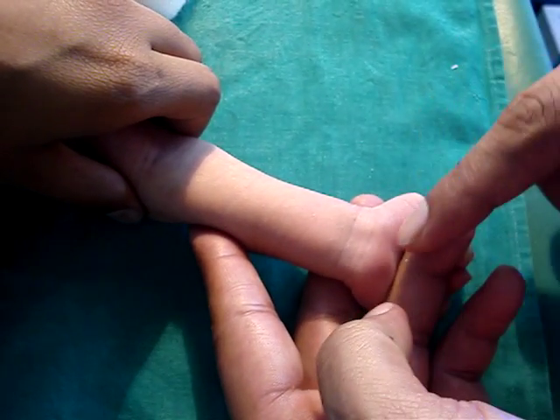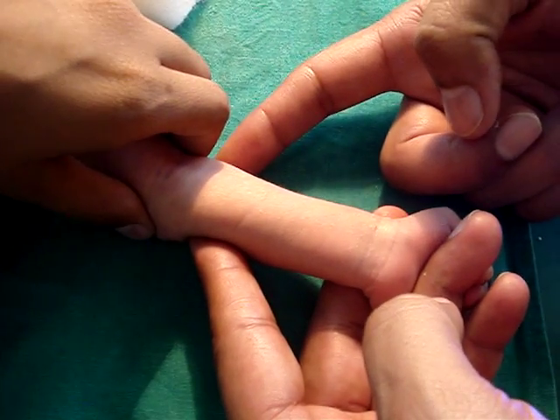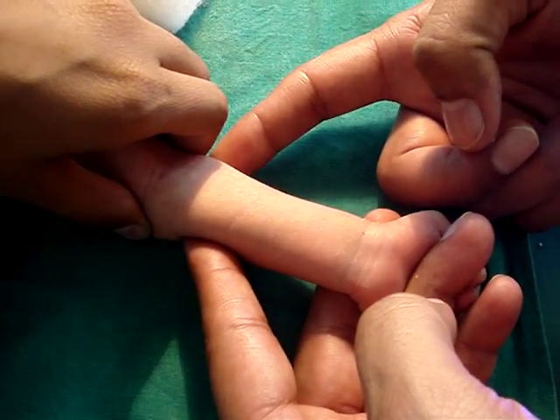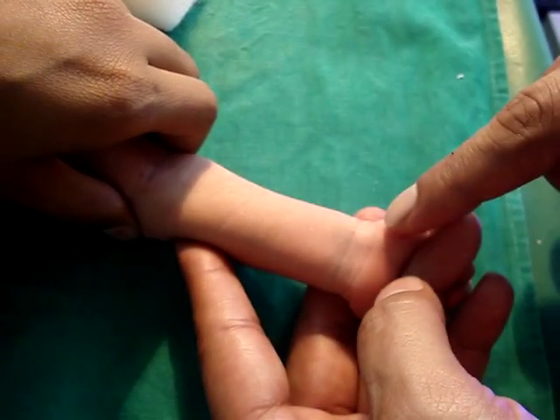Here, the wrist is made a little bit extended and the hand is supported. The upper limb is supported by holding the medial and lateral epicondyles of the humerus, and the wrist is kept flat.